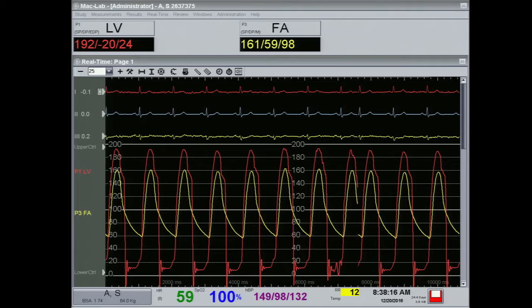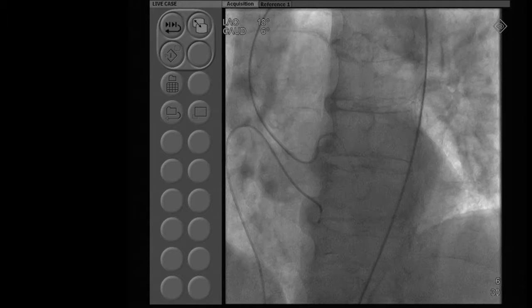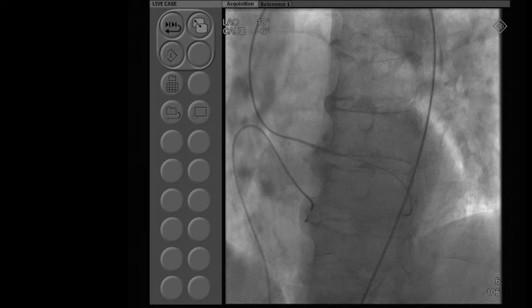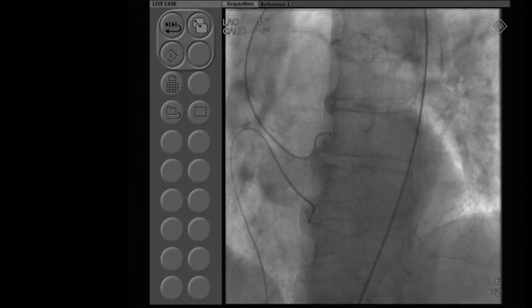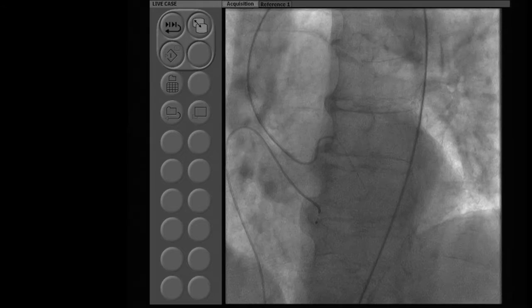We use the AR2 catheter — that is our preferred catheter. If you see here the LAO view with the AR2, which we use in the majority of cases depending on root size. We use a straight Terumo wire to cross. In the LAO view, many times you can see the opening of the aortic valve, rotate the catheter so it faces the opening, and you get the wire in as just shown here.